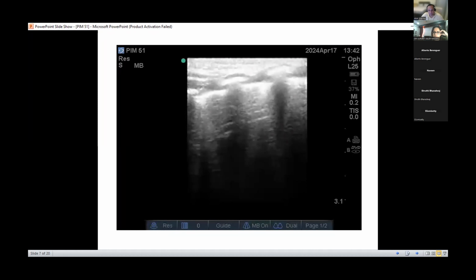Well done. Was there a chest X-ray, Sujit? Just out of curiosity. Yeah, the chest X-ray was mildly hazy, but the expansion was good and it was not a white out kind of lung. Again, if you're confused, I'm going to talk to my department tomorrow, and using both can really help in that situation. But in terms of your clinical judgment, it's absolutely spot on.